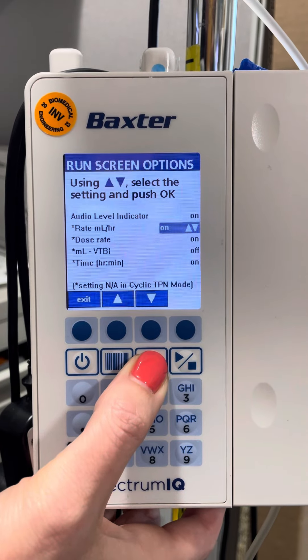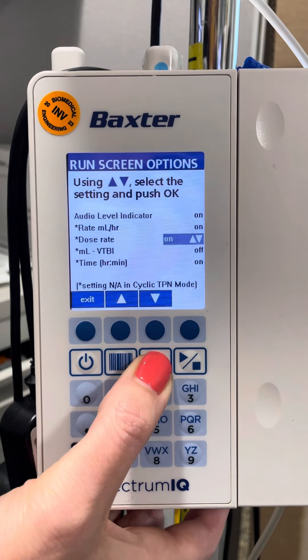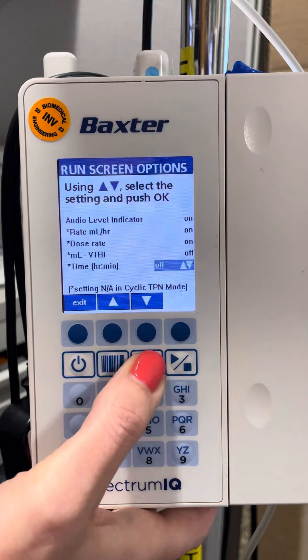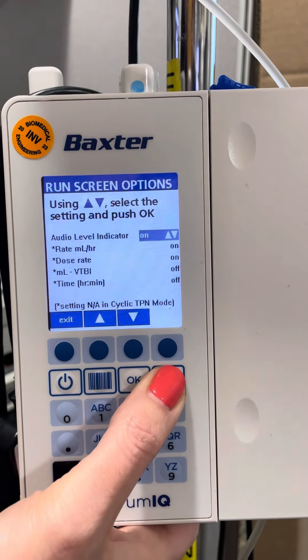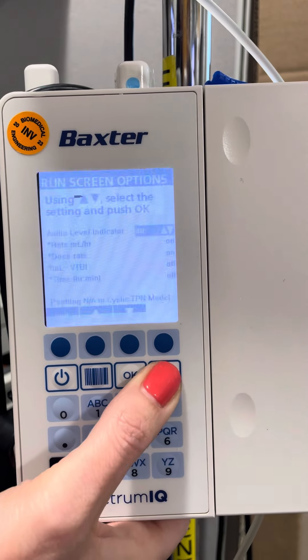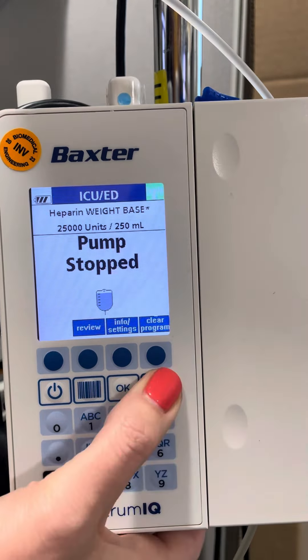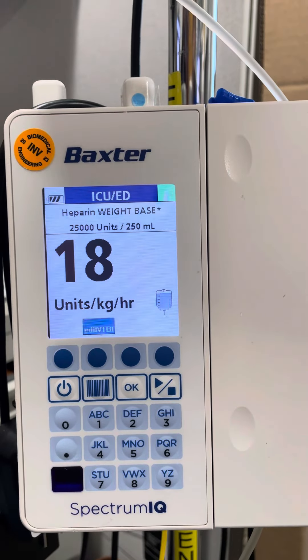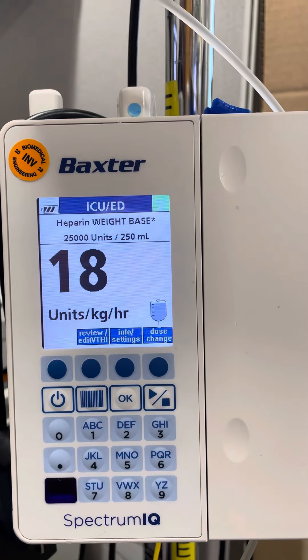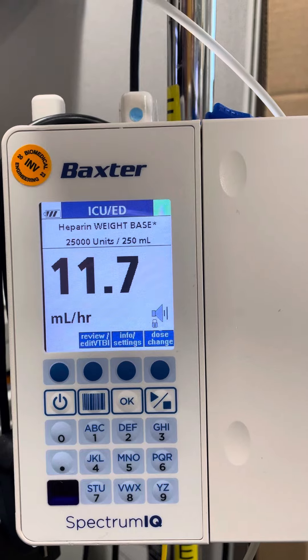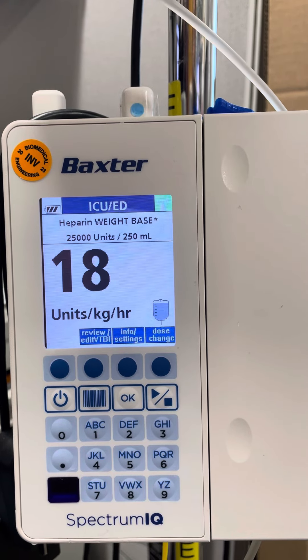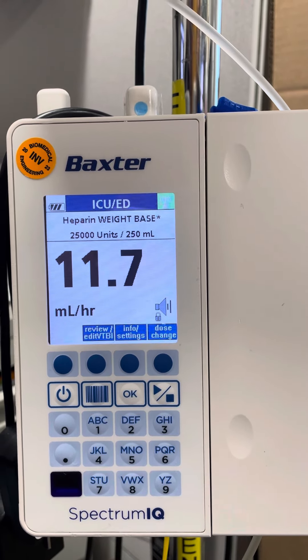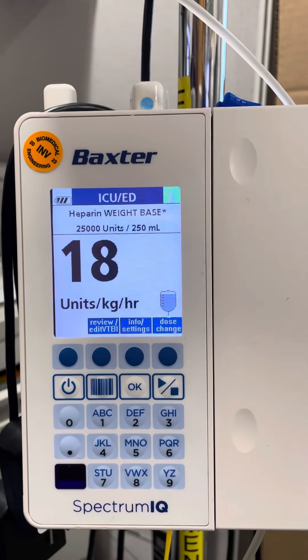Oh yeah, we left the time on by accident. Now we should just see dose, milliliters per hour — dose, milliliters per hour.